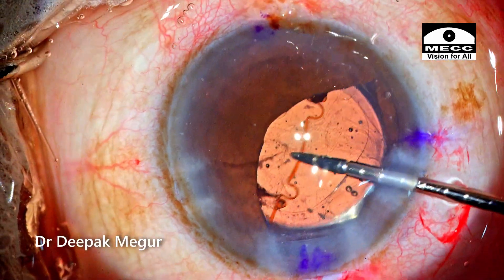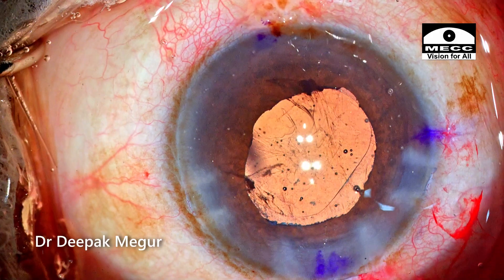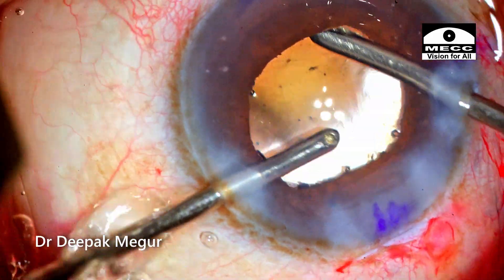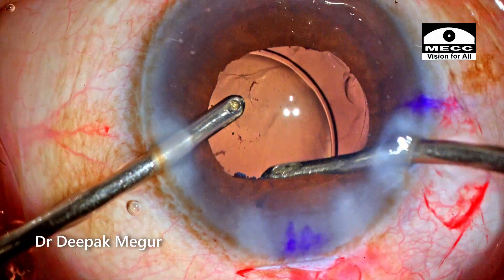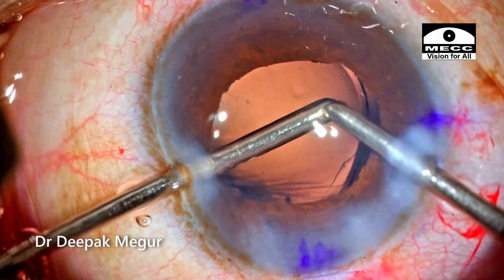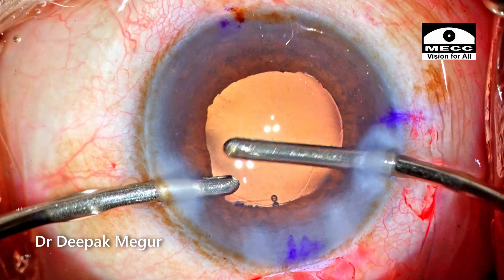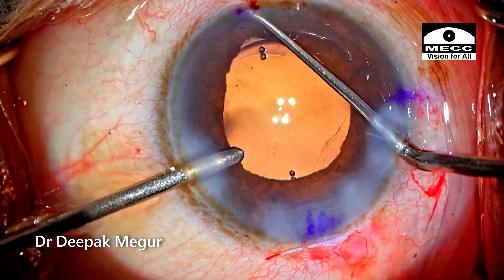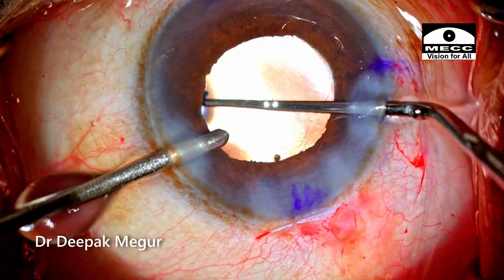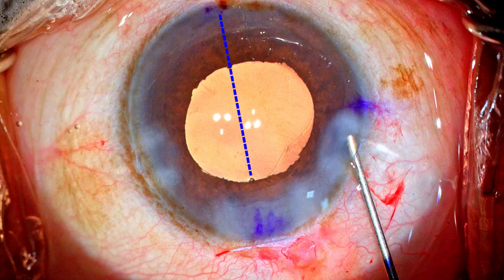Now I'm going to remove the B-Hex device while the viscoelastic is still inside the eye. The device is disengaged from the pupillary margin and pulled out. The viscoelastic is aspirated from in front and below the intraocular lens. It's important to ensure that the bag is totally devoid of any viscoelastic so that the lens has a great opportunity to adhere to the posterior capsule. Now is the time to align the lens properly — with irrigation running in my left hand, I ensure the marks are well correlated with the intended axis.